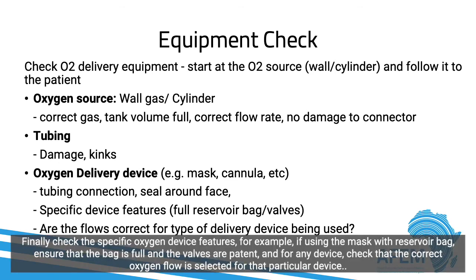Finally, check the specific oxygen device features. For example, if using the mask with a reservoir bag, ensure that the bag is full and that the valves are patent. And for any device, check that the correct oxygen flow rate is selected for that particular device.